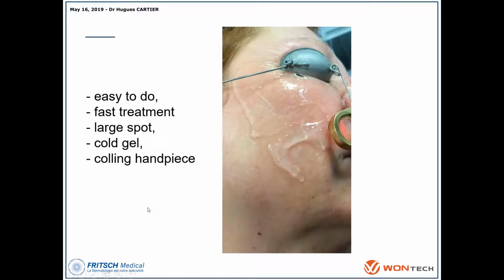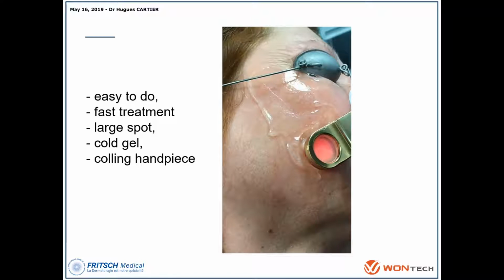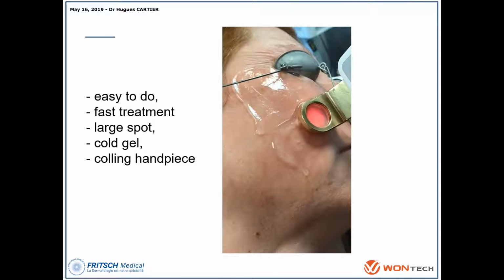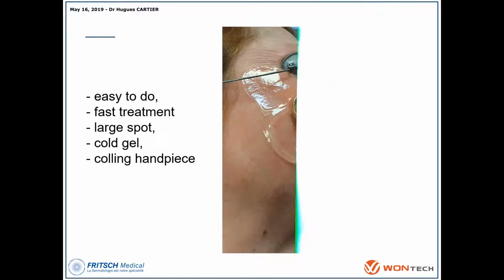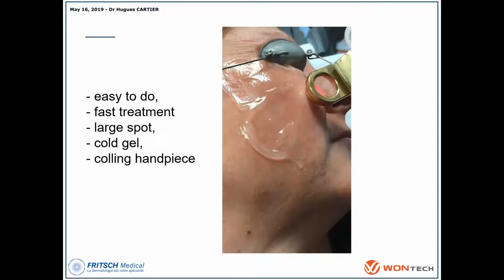I explained to you, for this patient, she wants to rejuvenate her face. So it's easy. In these cases you use KTP. You use a frequency of 1.5. You try to treat the complexion. It's easy with the KTP because at first you can treat some vascular disorders, but we know that you can also modify the complexion of the skin, and you proceed over the whole area. You use the KTP with a low setting, and you can do many sessions, and you clear the skin.